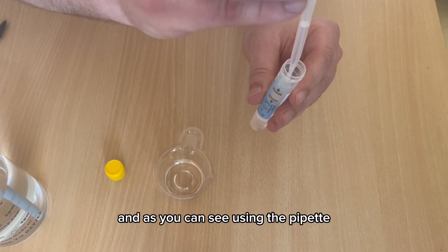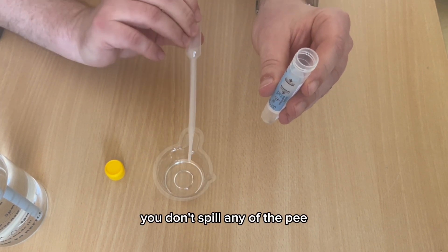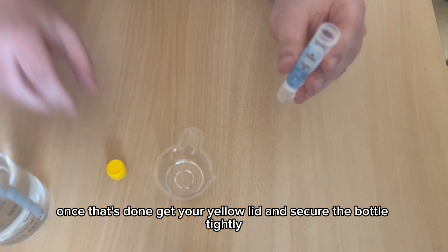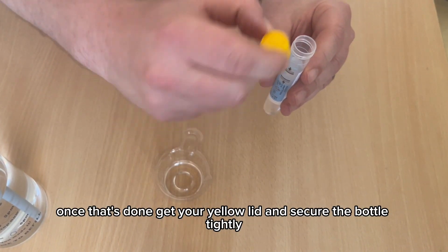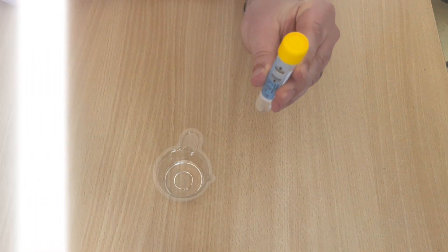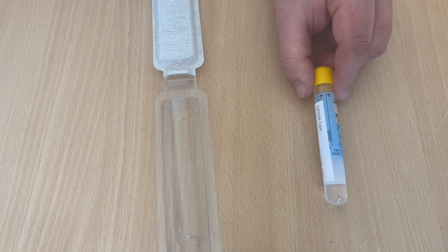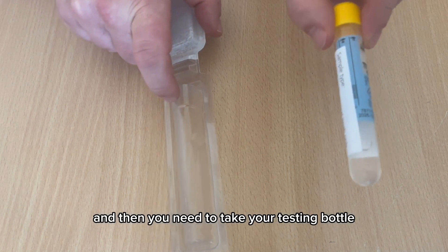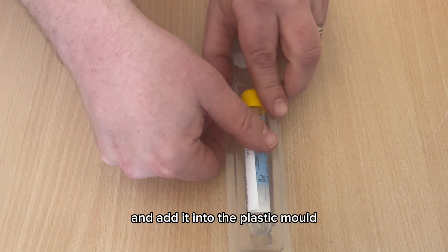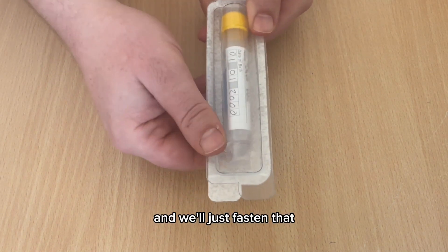Using the pipette, carefully transfer the urine so you don't spill any. Once that's done, get your yellow lid and secure the bottle tightly. Dispose of any excess urine in the toilet. Then take your testing bottle and place it into the plastic mold — this will make sure there are no spills during postage. Fasten it tightly.